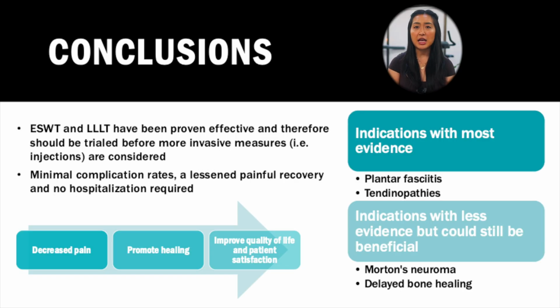So in conclusion, after reviewing the current literature, there is strong evidence to suggest that both shockwave and laser therapy are effective modalities that should be trialed before more invasive measures such as injections are considered, due to them being less invasive and less painful in nature. Overall, the evidence does suggest that both modalities can help to promote healing and decrease pain. With a reduction in pain, we are then able to improve our patients' quality of life through education and implementing good exercise habits through physical therapy.